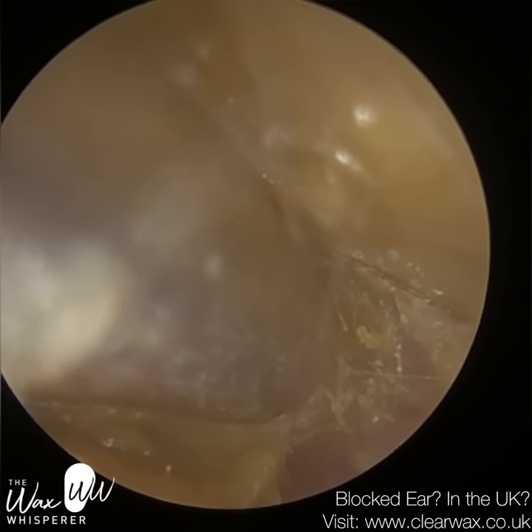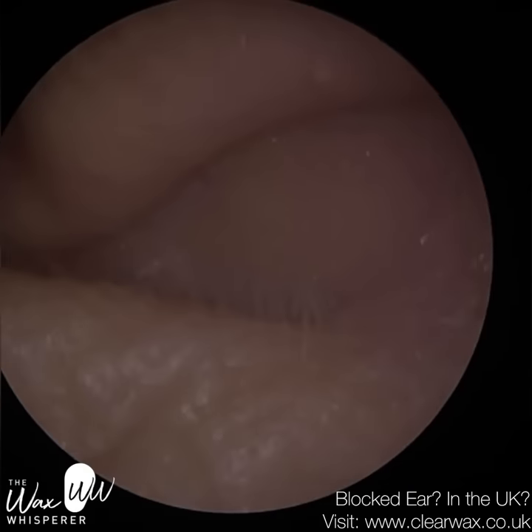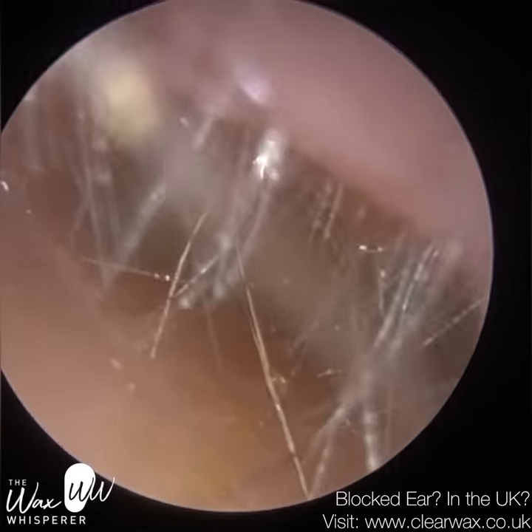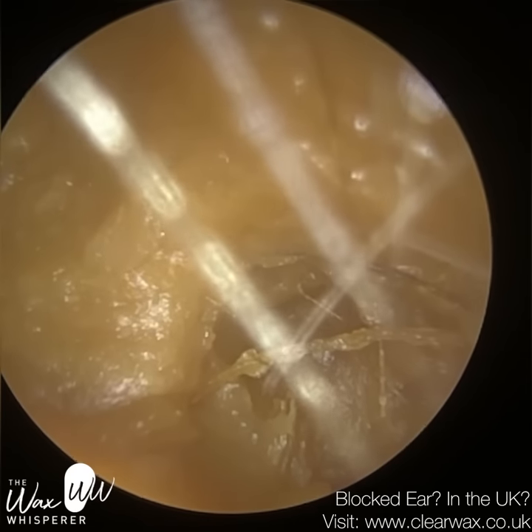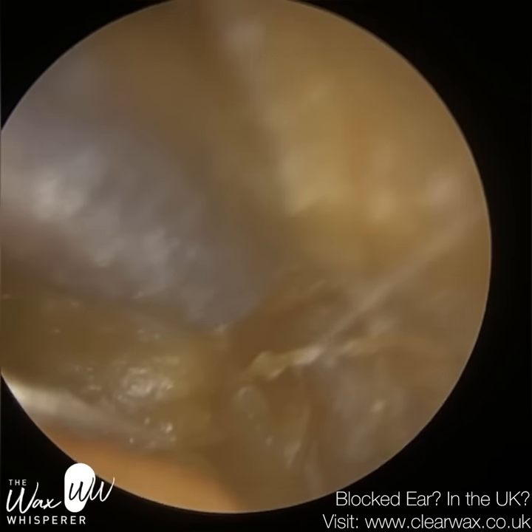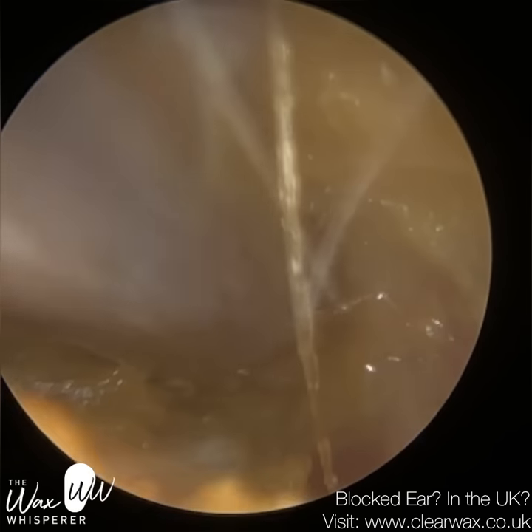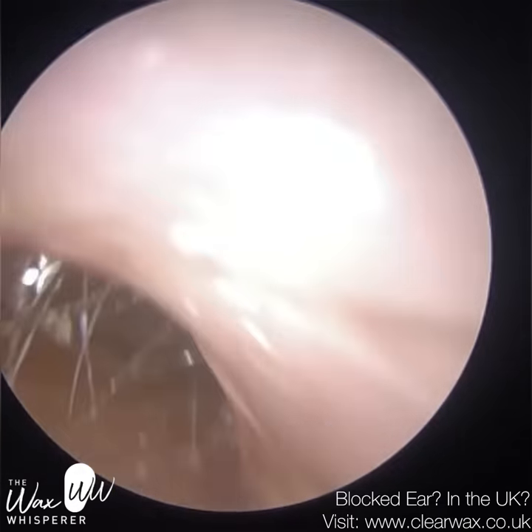You can see this occlusion, this dead skin and wax — it's very glutinous, very mushy. It's the most difficult type of occlusion to remove because, ideally, when you're performing microsuction or removing wax, when you make contact with the wax either with the suction probe or with an ENT micro-instrument, you're hoping to retrieve it and extract it in big lumps and pieces. But here it's all smothered — it's like soft butter, that's the best analogy I can give.